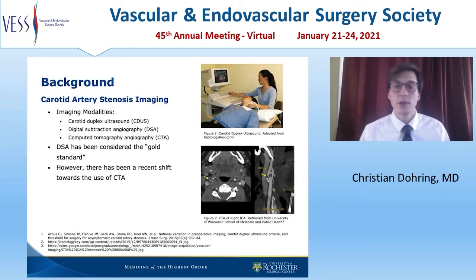Recently, there has been a shift towards using CTA as a new gold standard over angiography due to its less invasive nature, ability to obtain multiplanar views, and better visualize plaque morphology. CTA is also a more standardized imaging approach, while DSA is often operator dependent.